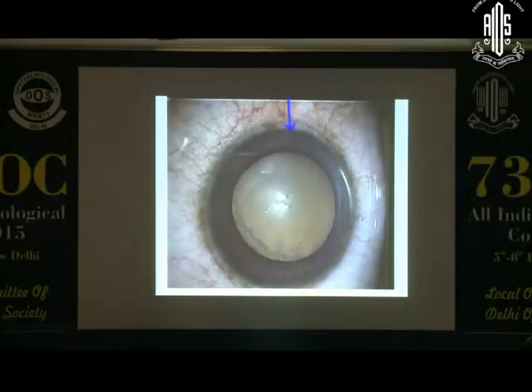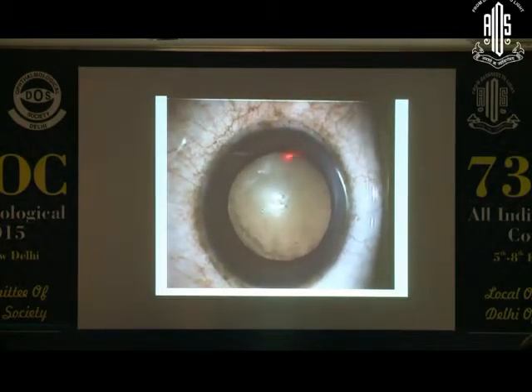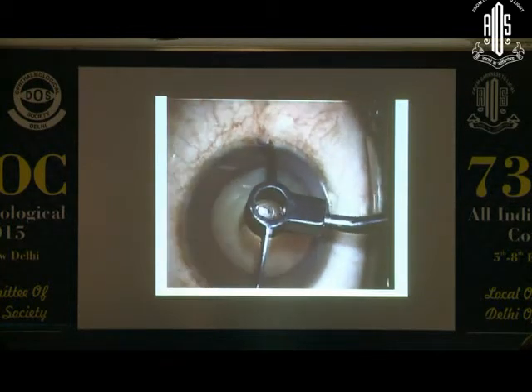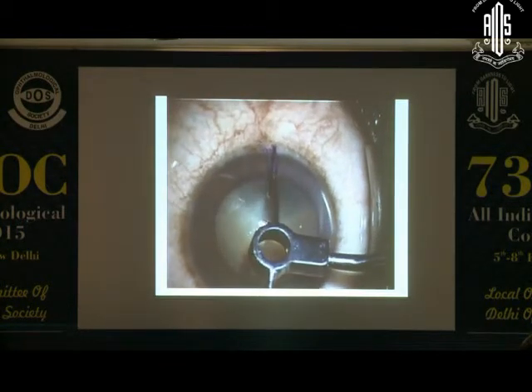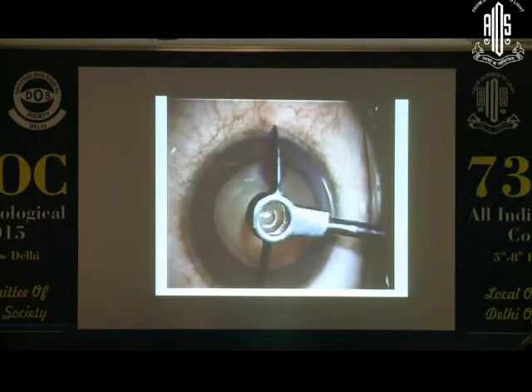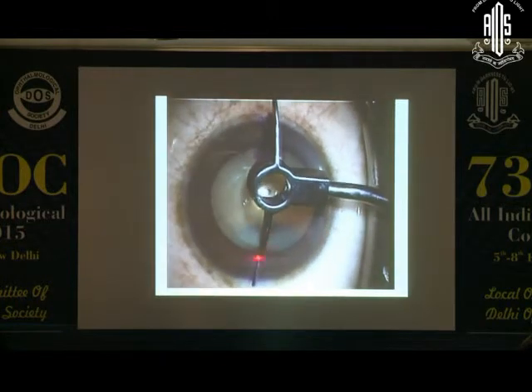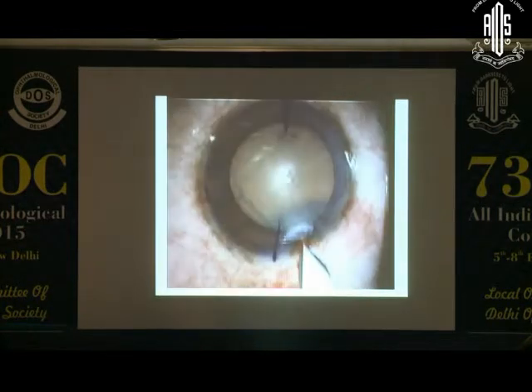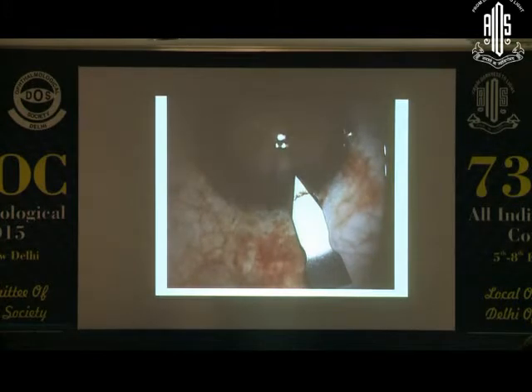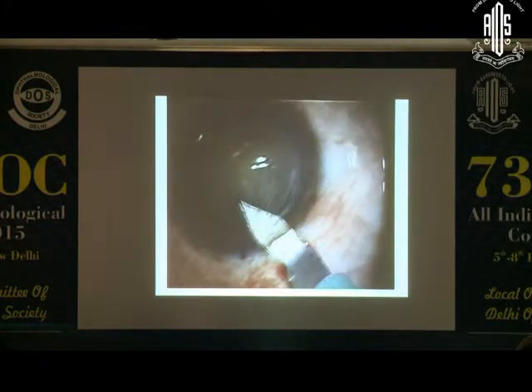So for video here, I've got two videos. Here's one that was going to the 175. I've got the 180 and 175 mark with a needle. You can see the needle mark. I use the trypan blue to make the mark thin and long, so it will go into the pupillary area so that you can avoid parallax error. If your markings are in the periphery, you can have a parallax error.